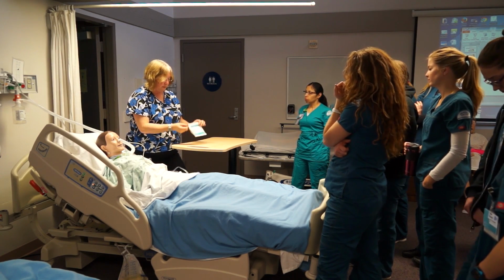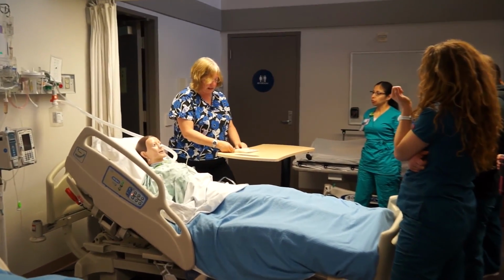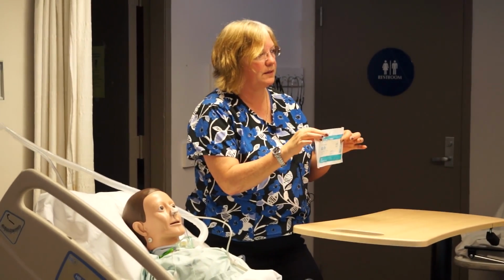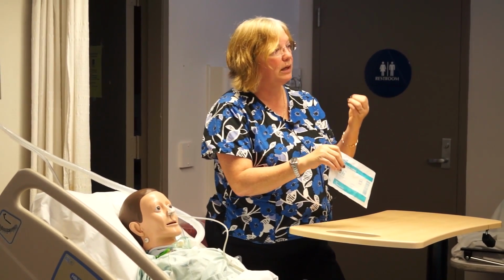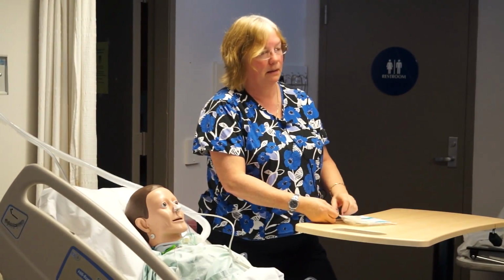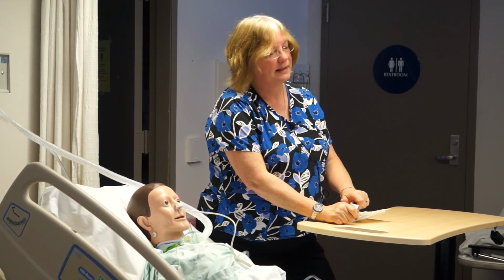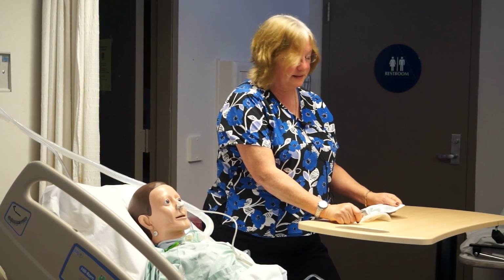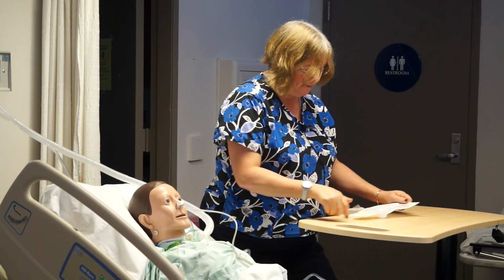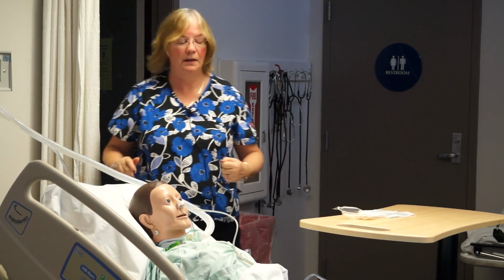So I've got a number 10 trach here and a number 10 suction catheter. If I have a really small trach, I want a smaller suction catheter. I don't want to completely occlude the inside diameter of my trach. I have assessed my patient first: I've assessed his breathing, his O2 sats over here, and I've listened to his lungs.